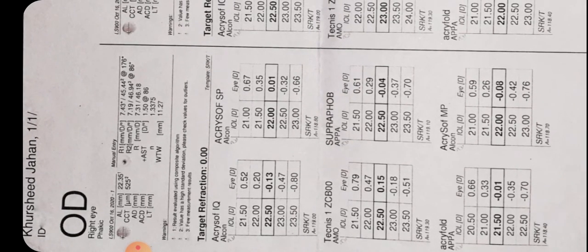and it also suggests which power is suitable, but ultimately the decision depends upon the doctor, whether he wants to make the patient myopic so that at a later time the person will have less difficulty reading near objects, or whether he wants to give the patient full correction. It depends upon the surgeon who is performing the cataract surgery.